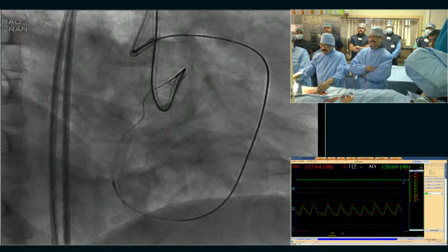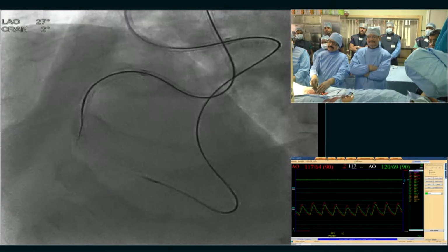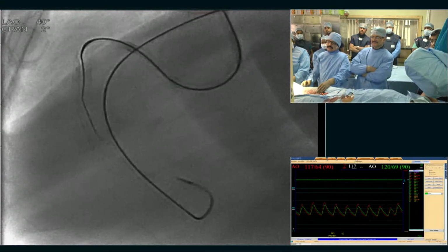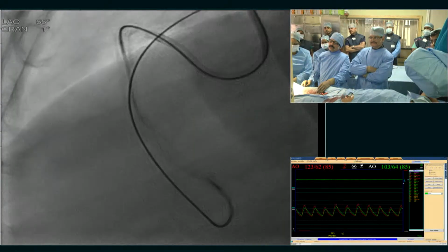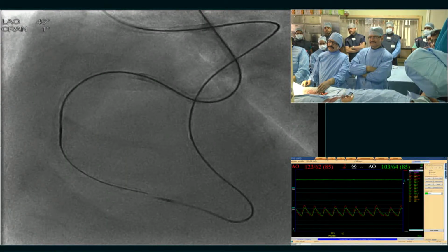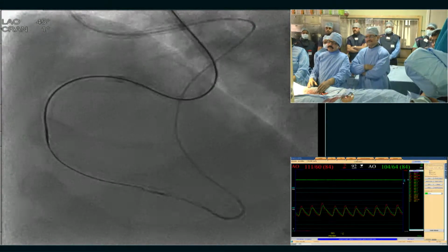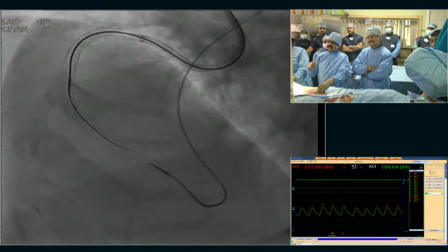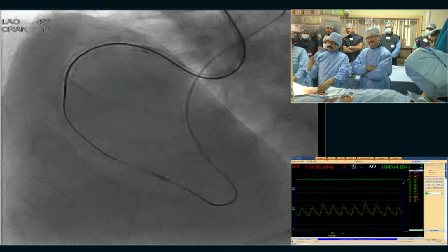One of the techniques I usually follow, if I feel there is in-stent restenosis, I quite often do a Rendezvous technique, which I tried in this case. But finally, a Gaia 3 could cross the antegrade. We almost tried a Rendezvous technique, but we could not succeed. Then finally, with a selective retrograde injection with the Corsair. Next.